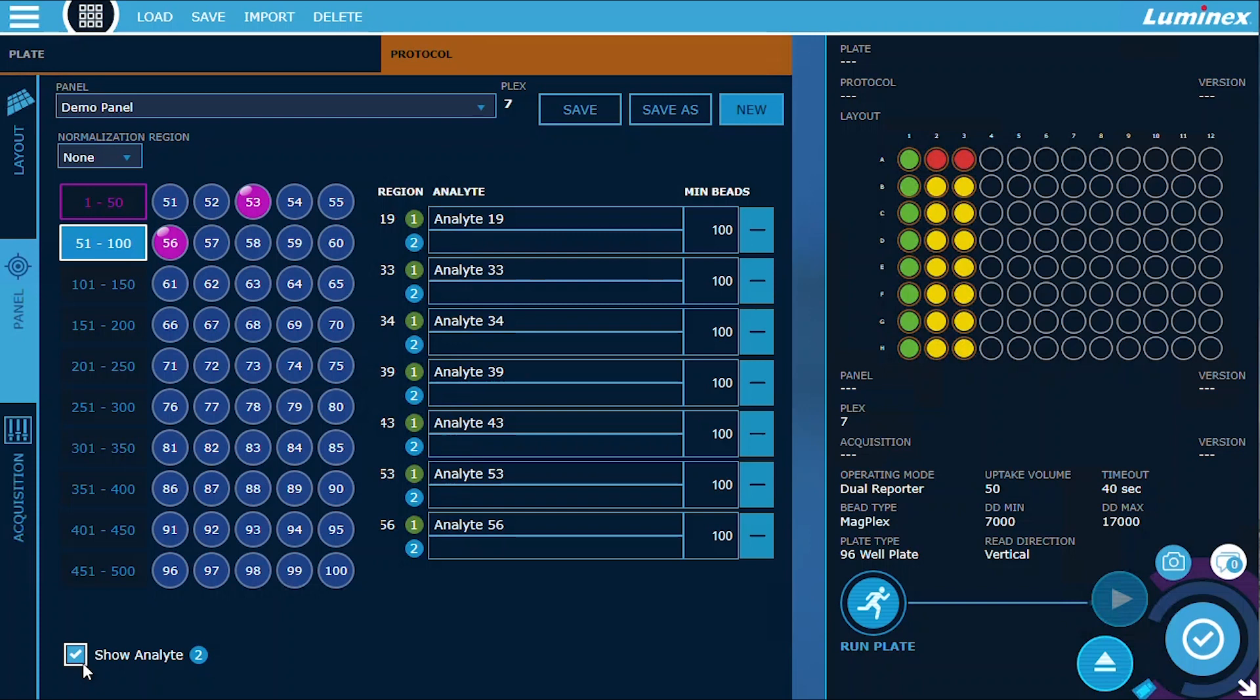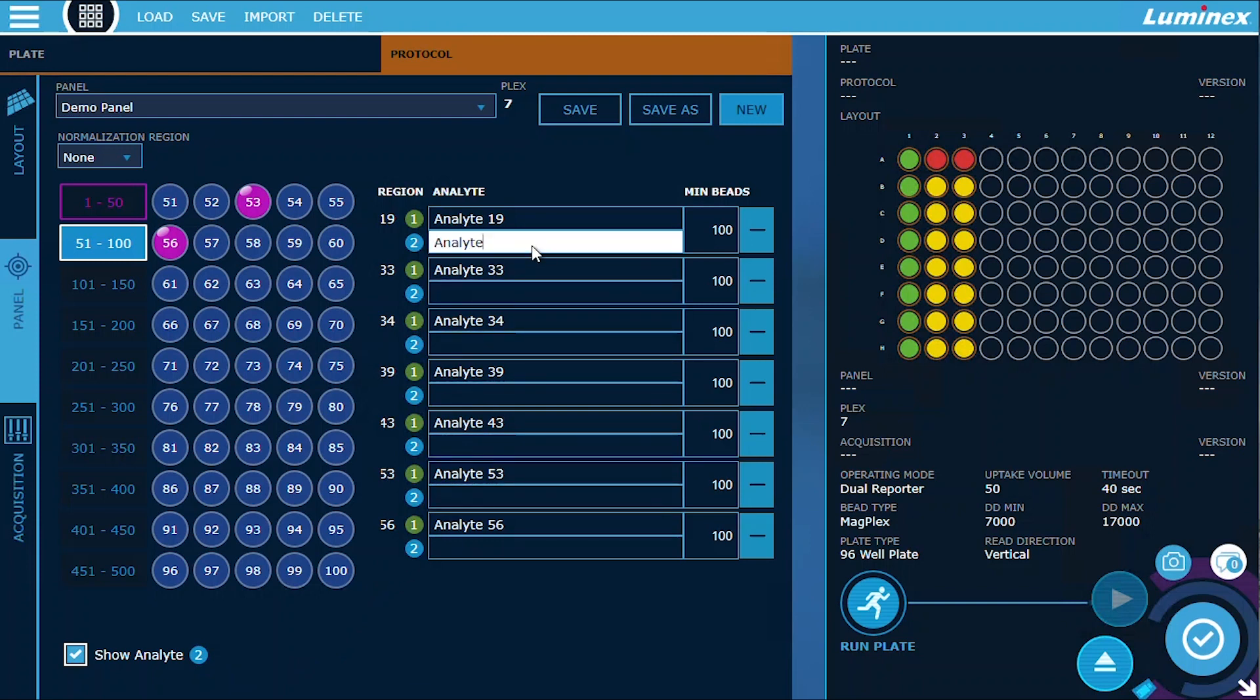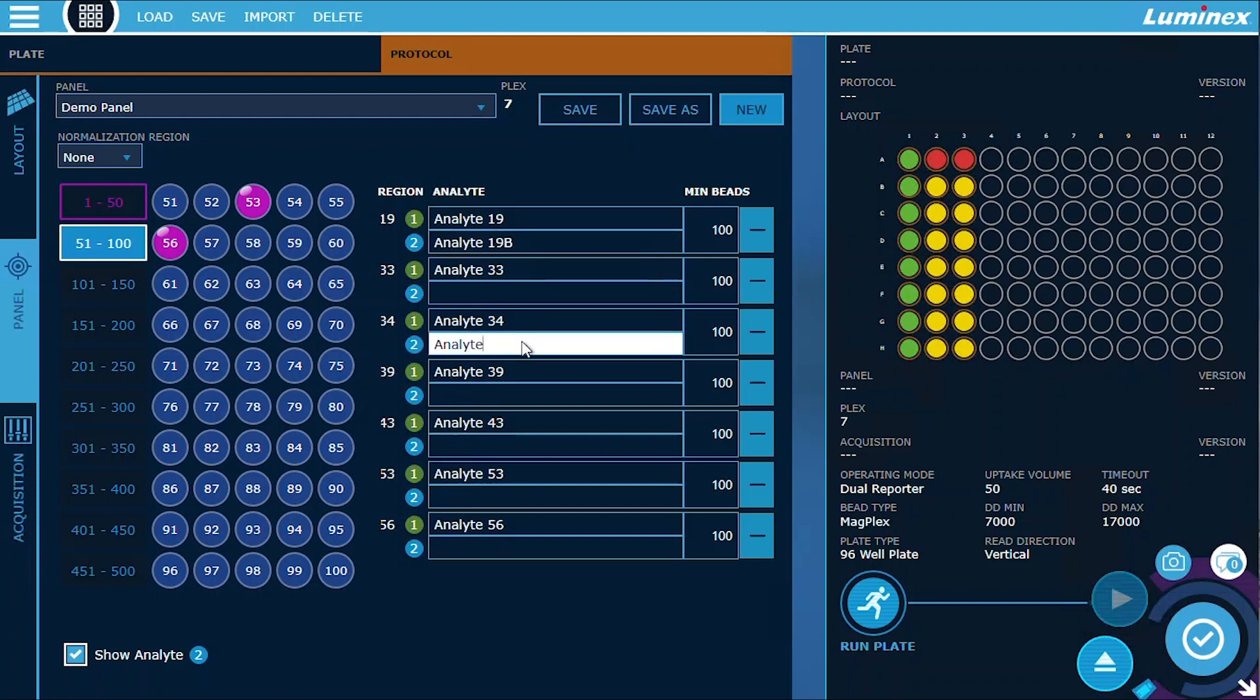Furthermore, for dual reporter assays, each region may have different requirements, and not all of them require the second channel. With our latest update, the name field for the second reporter will no longer autofill, giving you the flexibility to quickly tailor the panel to your needs.